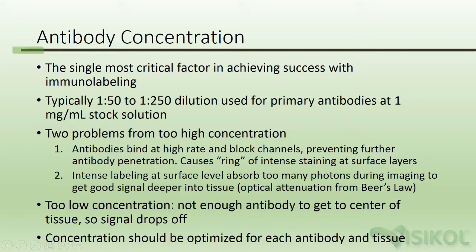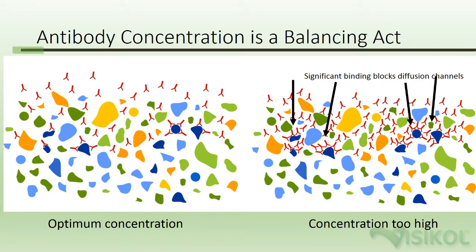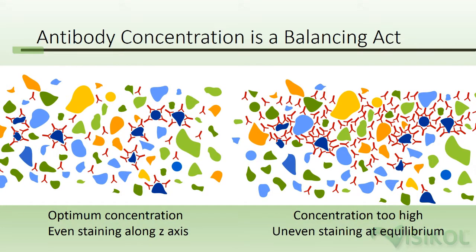Intense labeling at the surface causes too many photons to be absorbed during imaging to get a good signal deeper into tissue — this is optical attenuation due to Beer's Law. Too low a concentration means not enough antibody will reach the center of the tissue, so the signal drops off. Concentration should be optimized for each antibody and tissue. At optimum concentration, antibodies penetrate and label evenly along the Z-axis. With concentration too high, we obtain uneven staining as a large amount of antibody is stuck in the upper layers.